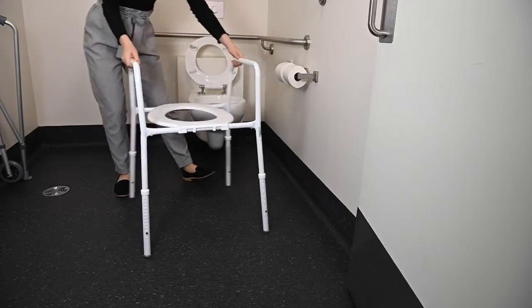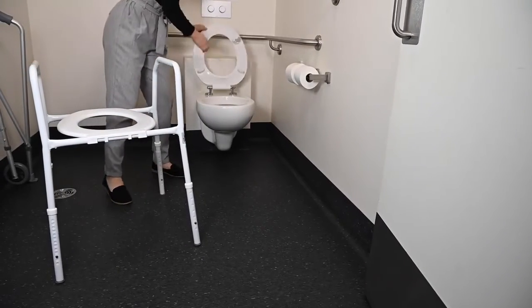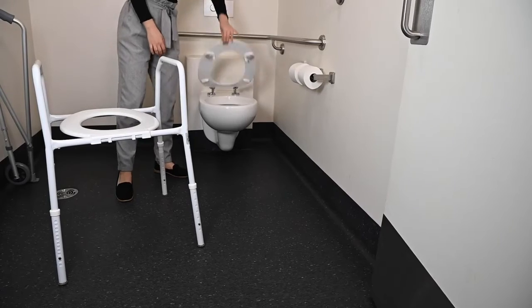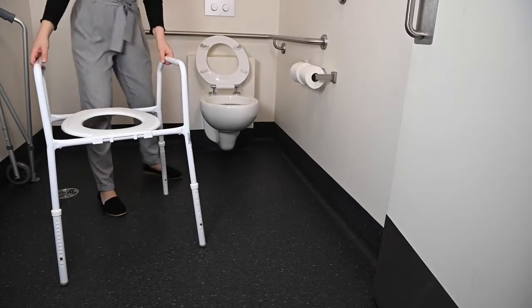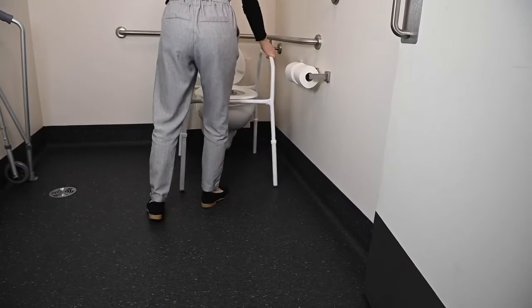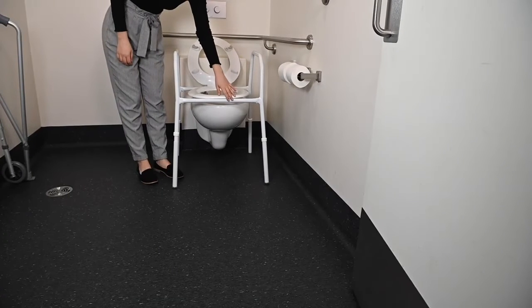To position your over toilet frame correctly, you must first lift your toilet lid and toilet seat. Then place the toilet frame over your toilet so that the frame seat is in line with the toilet bowl. The front of the frame seat will be rounded while the back will be square with a hinge.